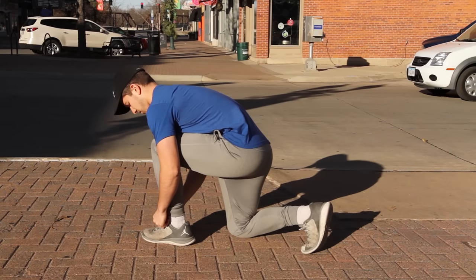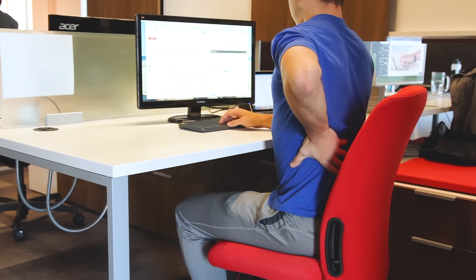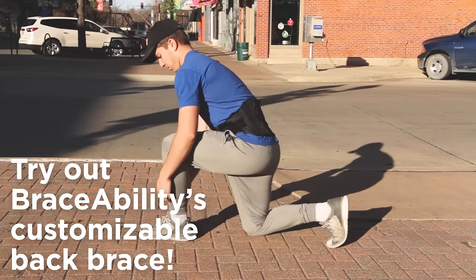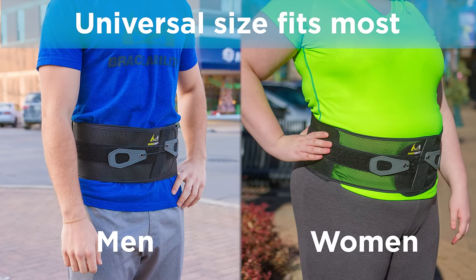Are you looking to alleviate acute or chronic low back pain, low back strains and sprains, or disc herniation? BraceAbility is introducing a fully customizable back brace that will comfortably fit men and women in most any body shapes.